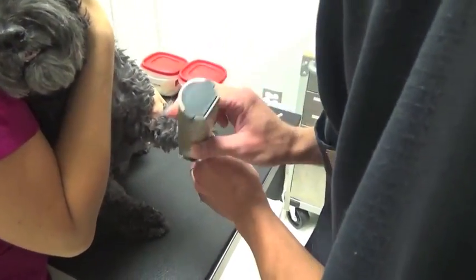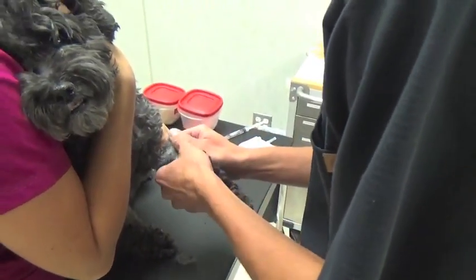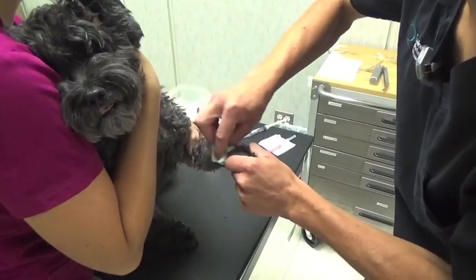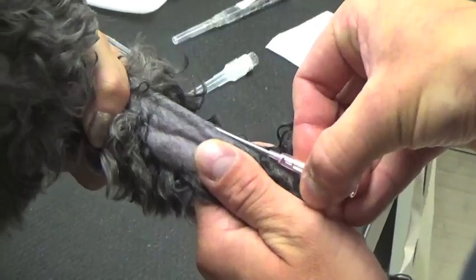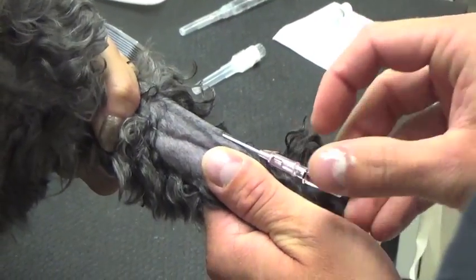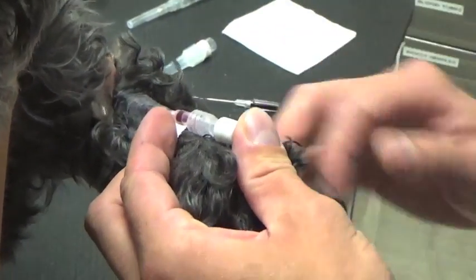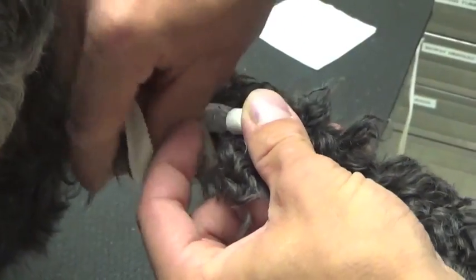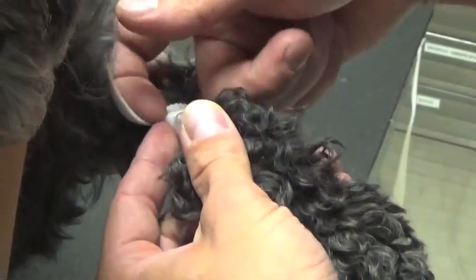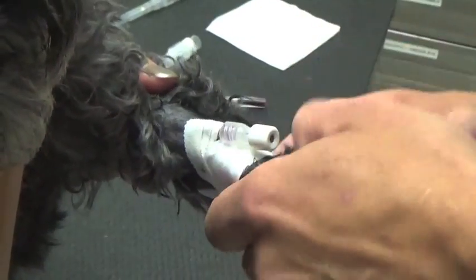Today's patient is receiving an examination of her nasal cavity to determine the cause of chronic sneezing and nasal discharge. Once the pre-anesthetic drugs have taken effect, an IV catheter is placed in a peripheral vein. This catheter provides access to support blood pressure with IV fluids administered throughout the procedure. Intravenous access is then also available for administration of the anesthesia induction agent, contrast material, and other medications that may become necessary during the anesthetic period.